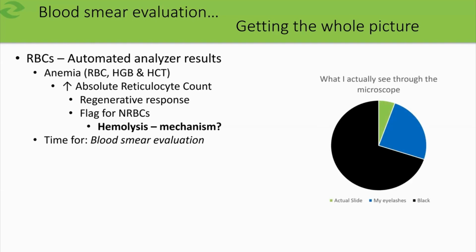Now, when I was a professor at University of Georgia and teaching the first laboratory to second-year veterinary students for clinical pathology and hematology, this was my unofficial research project. And I think I experienced it too when I was a veterinary student. However, I believe the green proportion for me was probably even less than what's shown here, and the blue portion was greater. But with experience, you can not see your eyelashes anymore.